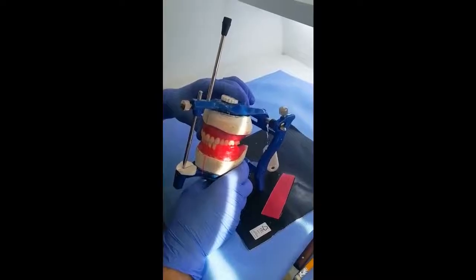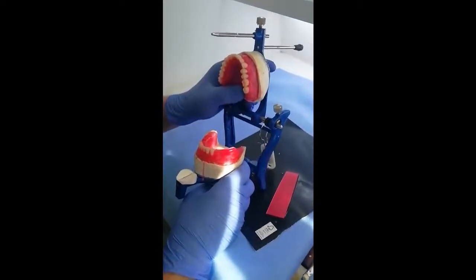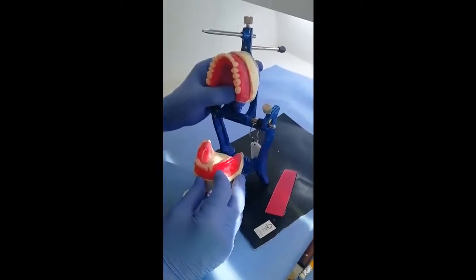maxillary teeth for proper placement. Often, errors in arranging maxillary posterior teeth may not become evident until mandibular teeth are set.